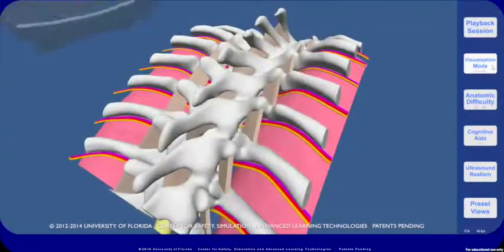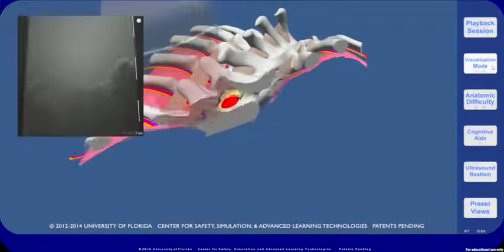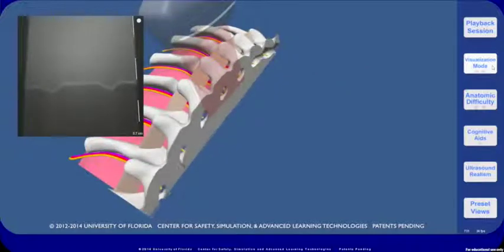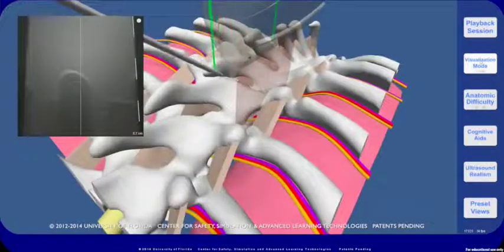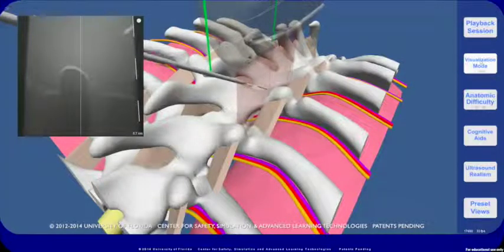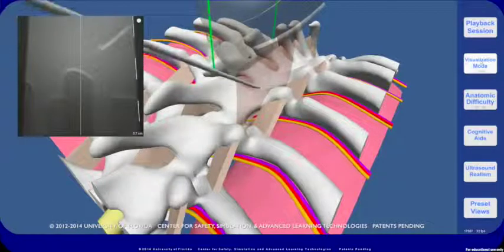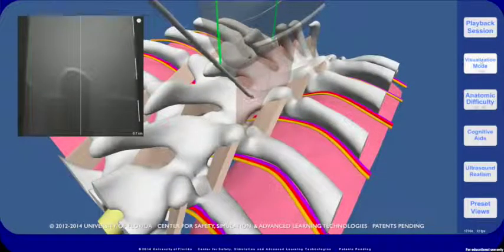A sheet of red light depicts the ultrasound insonating plane in the visualization. In one of the visualization modes, a hybrid cross-section displays all anatomy behind the cross-sectional plane. The simulation models needle and lung anisotropy — the needle view is lost in the ultrasound image at incident angles greater than 45 degrees, and a similar phenomenon also applies to the lung surface.